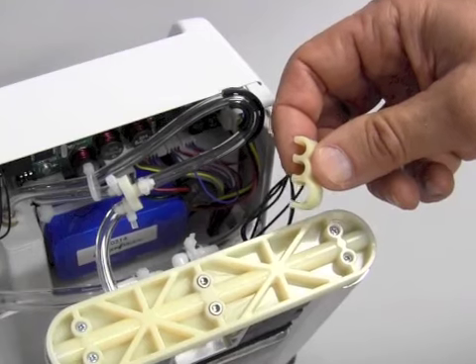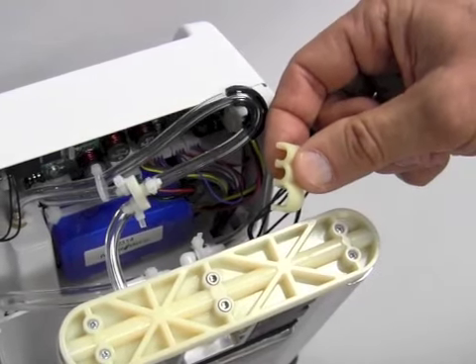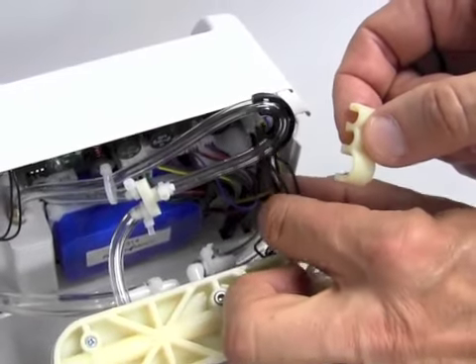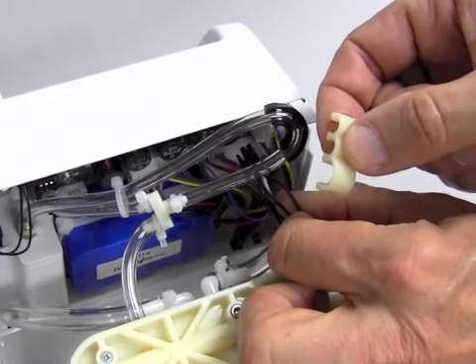Okay, the next step will be to put the clip for the Tygon tubing back in place, and then to plug in the circuit board, the plug from the sieve beds onto the circuit board.